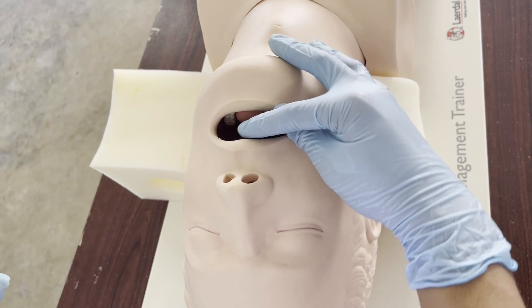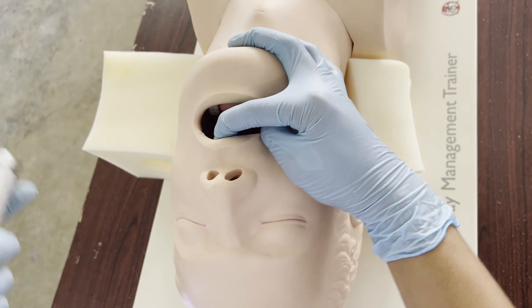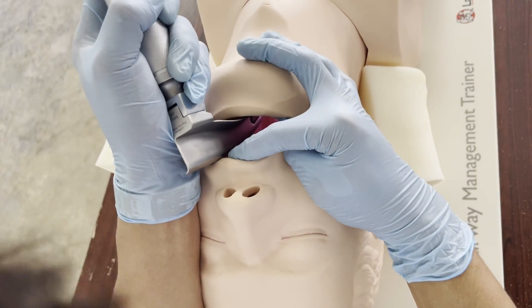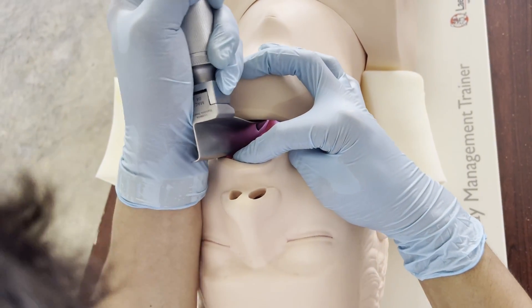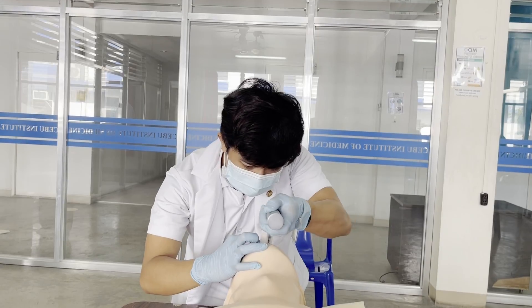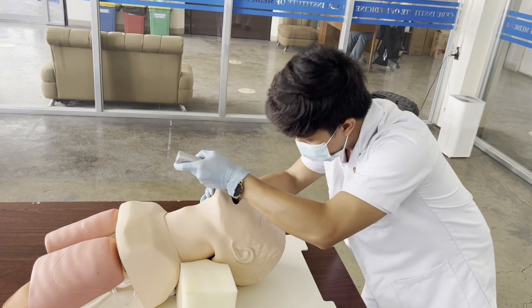Advanced airway. Open the mouth with the gloved right hand, scissoring two fingers by placing the thumb on the lower jaw and index finger on the upper jaw. The laryngoscope is held in the left hand and is inserted along the right side of the tongue, pushing the tongue to the left. Depth perception is difficult, so structures should be identified as the blade passes the tongue and the epiglottis. Traction is then applied along the long axis of the handle.